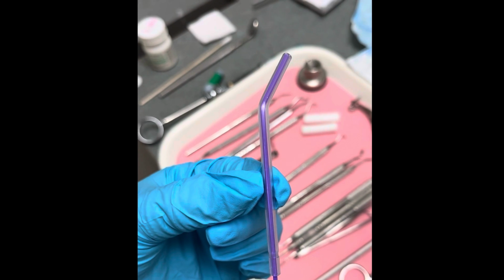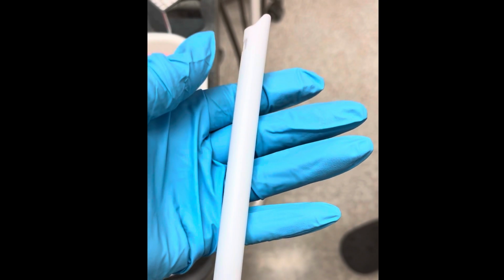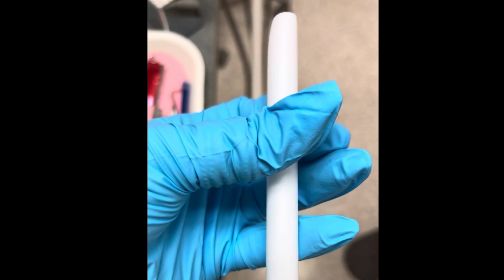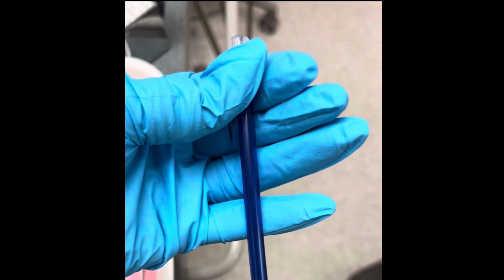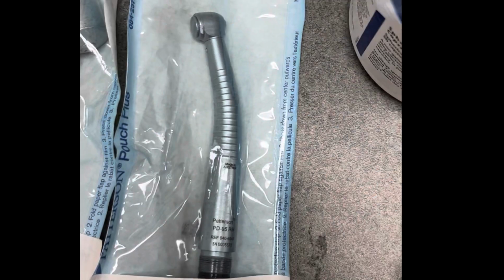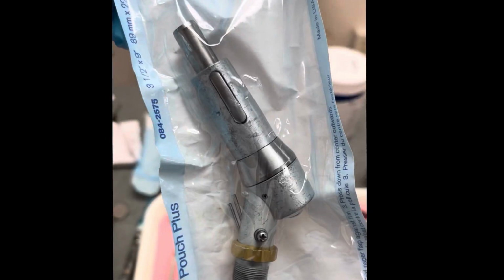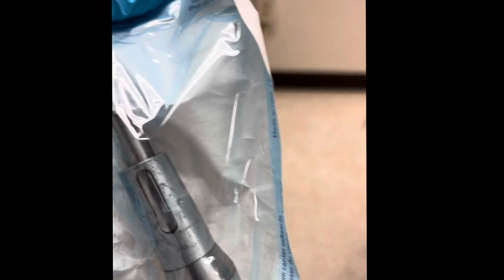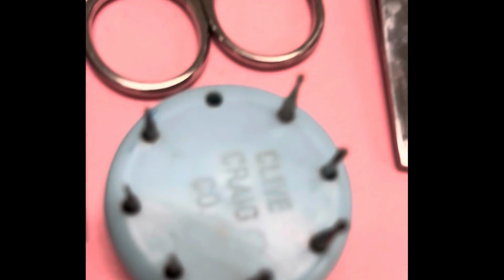I will be explaining the amalgam procedure in order. You're going to need a water syringe, an HVE, and a saliva ejector. The doctor will also need a high speed with a low speed also on the tray, with the doctor's choice of burrs. These are some of the burrs that he needs to have on the tray.